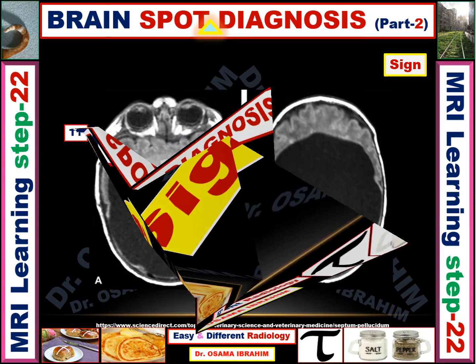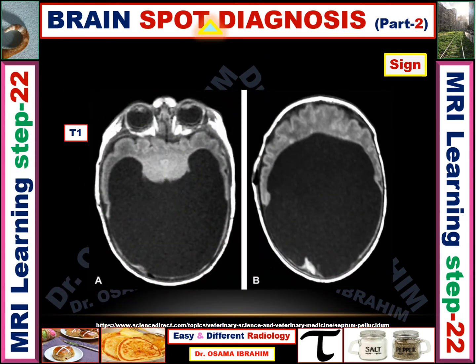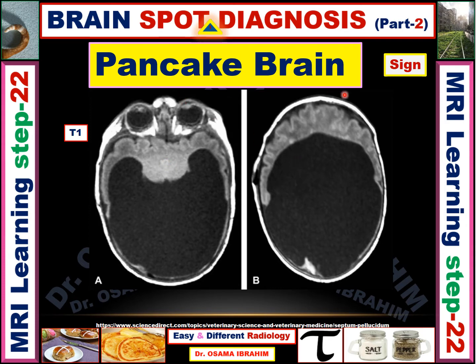Sign 7. This is a brain T1 without contrast for a pediatric age group, and also this is the same patient. The sign here is different and is called the pancake sign, or pancake brain sign.